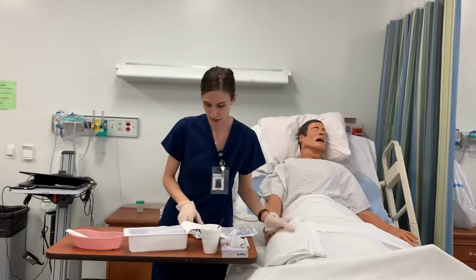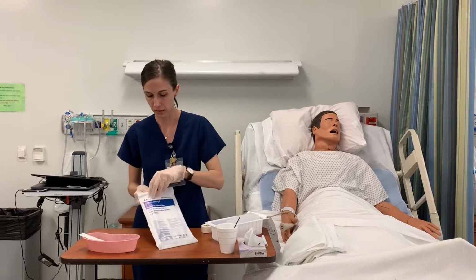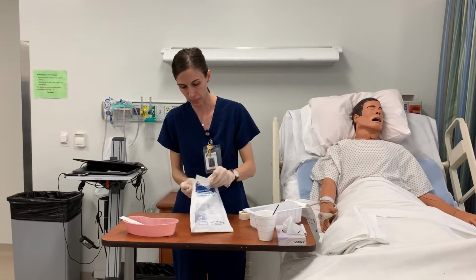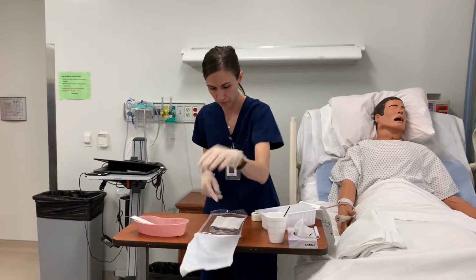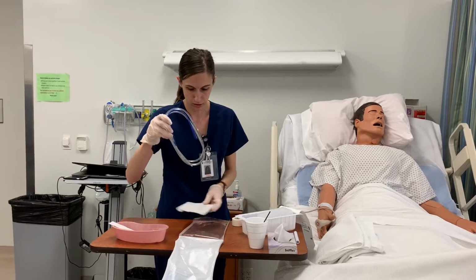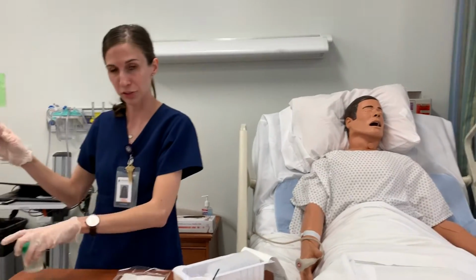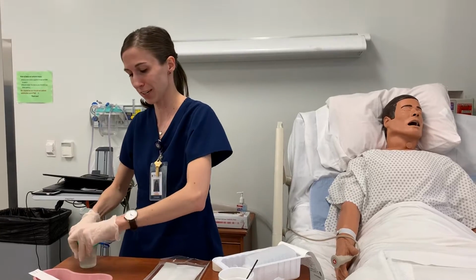Move this. I'm going to be setting up my NG tube. And I will just be measuring it really quick. You guys, your instructor will be holding your lubricant for you, but my person is holding my camera, so I'm just going to have that ready on the side.